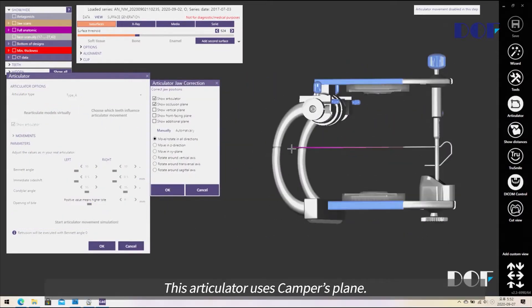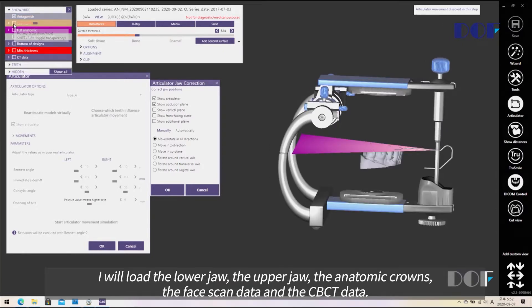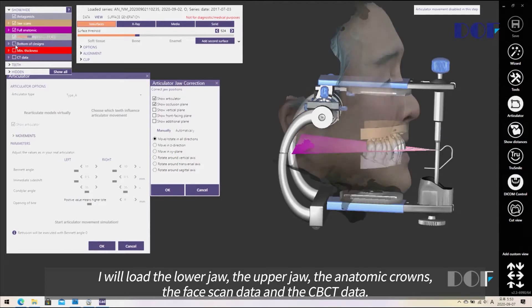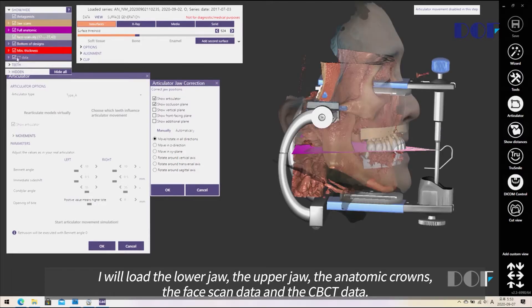This articulator uses Camper's plane, the upper and lower jaw, anatomy crown and face scan data, and CBCT data.